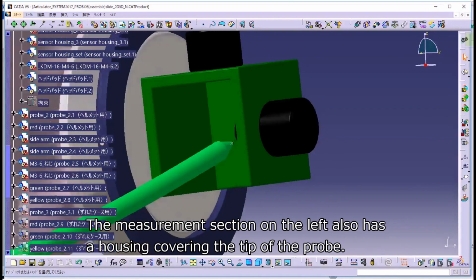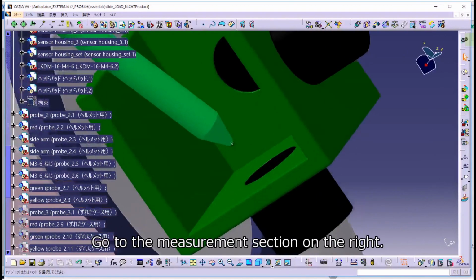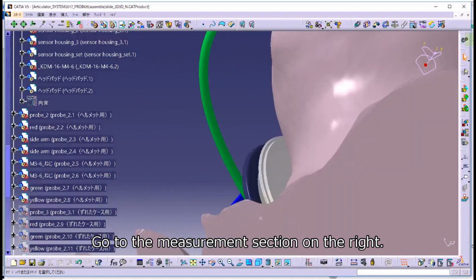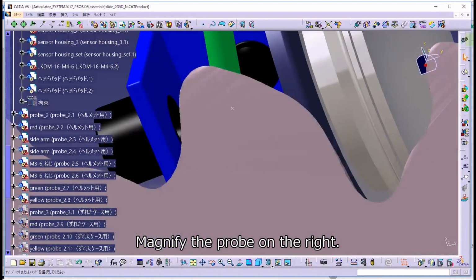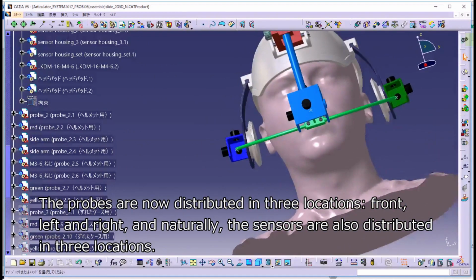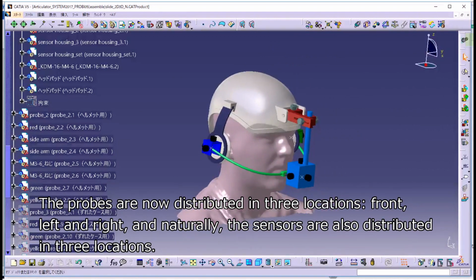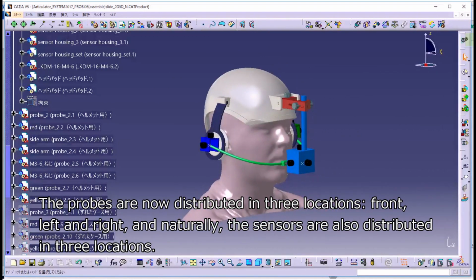The measurement section on the left also has a housing covering the tip of the probe. Go to the measurement section on the right. Magnify the probe on the right. The probes are now distributed in 3 locations: front, left and right, and naturally, the sensors are also distributed in 3 locations.